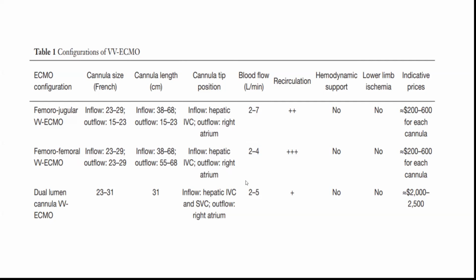The other thing to note is just the price. We use the dual lumen inflow because it allows your patient to be mobile. It's more comfortable. They usually require less sedation, but it is a more expensive modality to have that cannula in place.